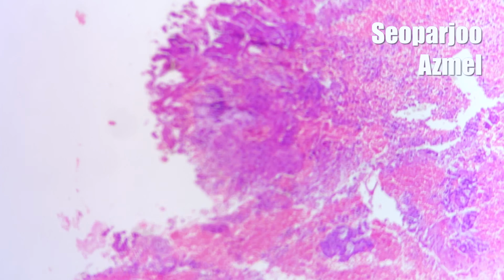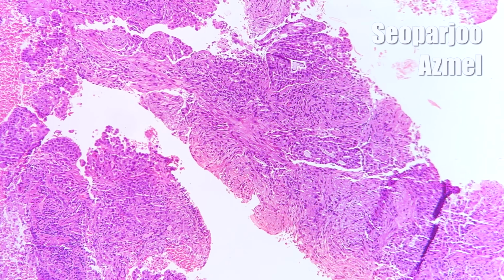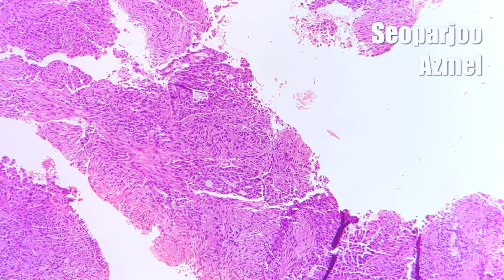Right, so that's how adenocarcinoma of the lungs looks in a histopathological biopsy.